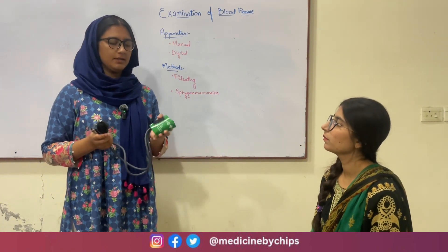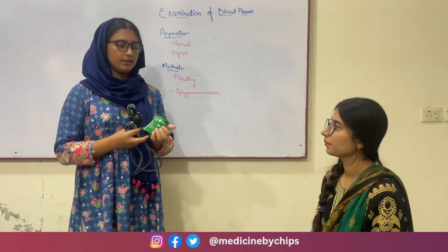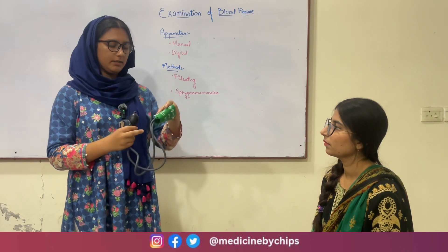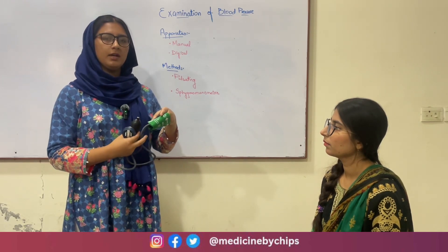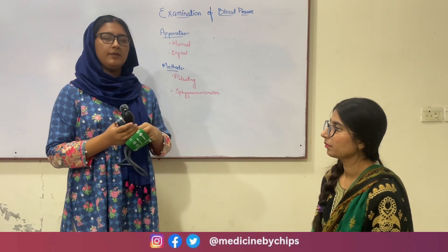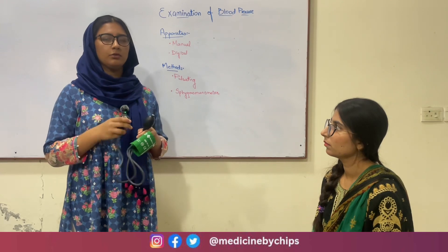This is the blood pressure apparatus. This is the cuff, this is the bulb, and this is the dial. We will place the cuff above the elbow so that the pipes of the cuff are directed medially and downwards.